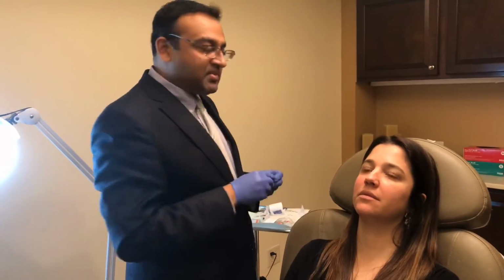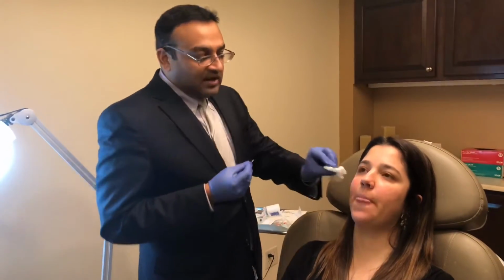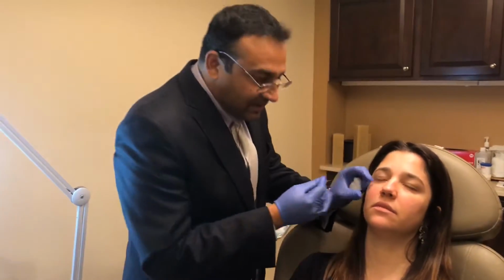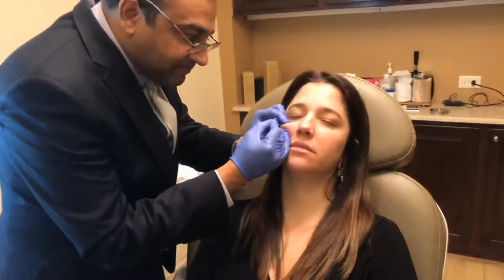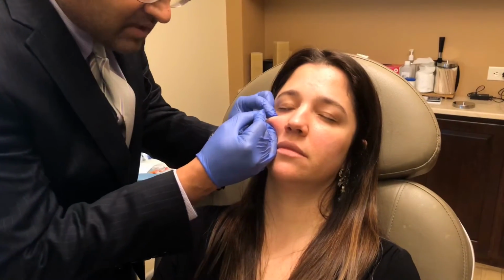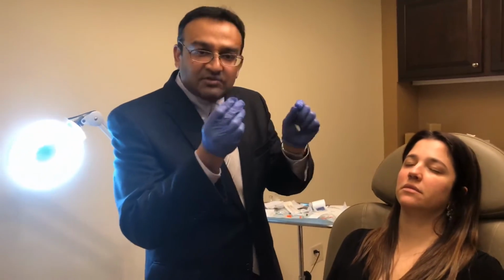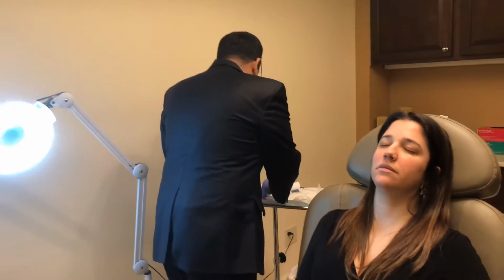So what we did was we just provided a little bit of anesthesia with a little bit of lidocaine mixed with a little bit of epinephrine. The epinephrine causes the blood vessels near that area to kind of constrict a little bit, so we minimize the bleeding. And so what I'll do now is, at the site we just gave anesthesia to, and it's very fast acting, I'm going to take a tiny needle and just make a very tiny hole at the same place, like so. And that tiny hole is my introducer hole, and through that hole I'm going to put in that cannula or that metal straw with that blunt tip, and we're going to fill everything from there.